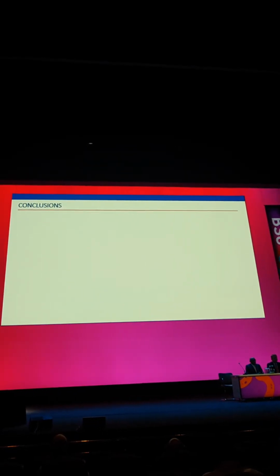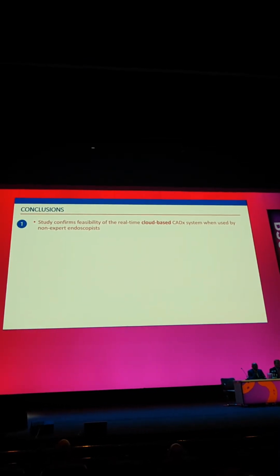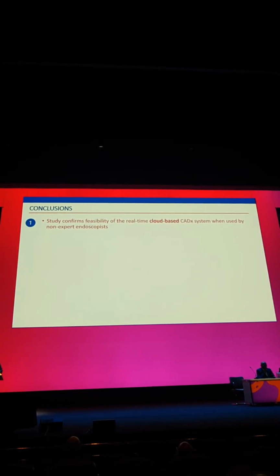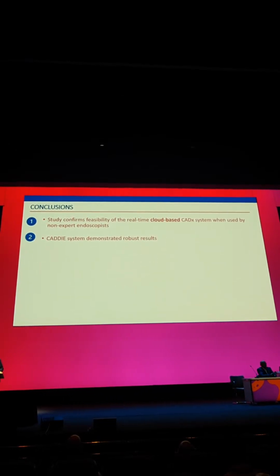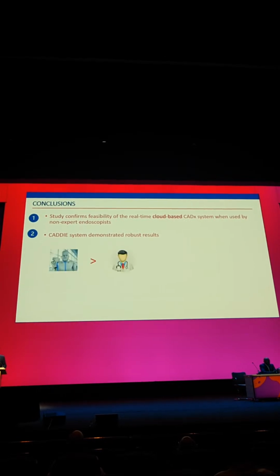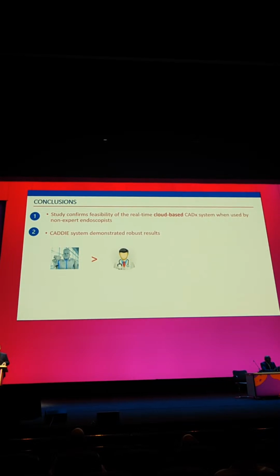So to conclude, I think first and foremost, we've clearly demonstrated proof of concept that this cloud-based system works in the NHS. This is spread out across 9 trusts in the UK, with a mixture of academic and secondary care hospitals. We've demonstrated very robust results for the CADx system. In the majority of these analyses, it was well in the high 80s in terms of sensitivity, specificity, and accuracy. And probably not too surprisingly, given this is a non-expert cohort, the CADx system outperformed the non-expert endoscopists.